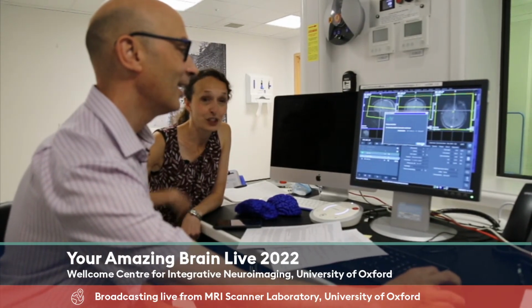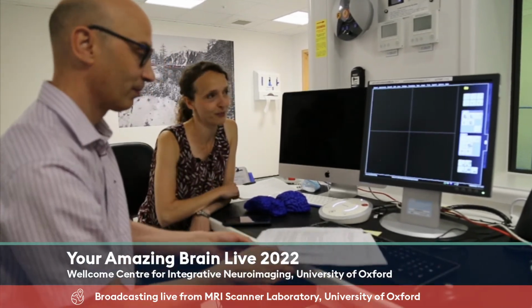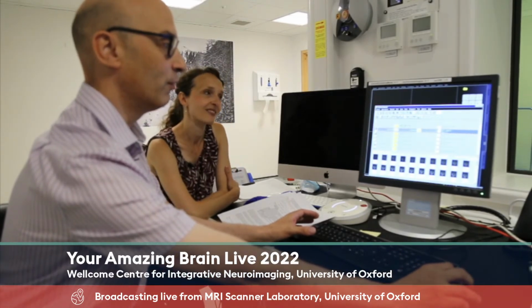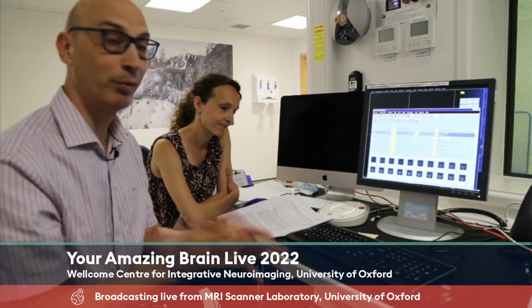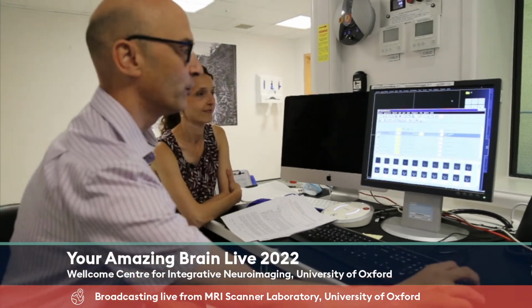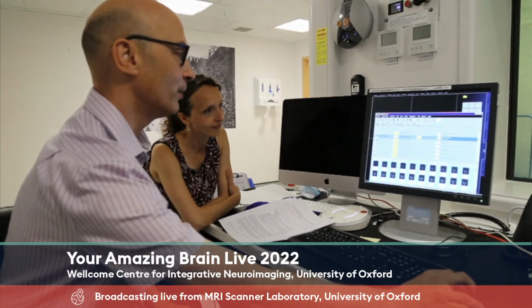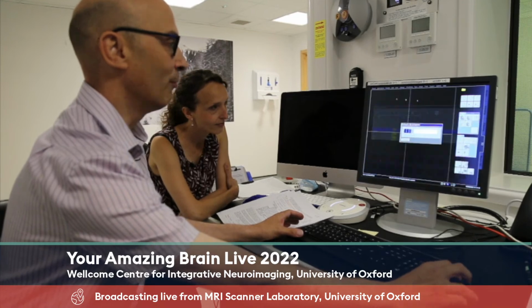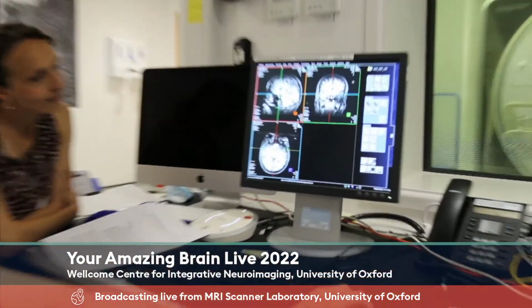Okay. So the measurements are coming in now as we speak, but it takes a little bit of time. So Stuart will talk us through what we're going to see. Right now we're taking a movie of what's going on inside Barbara's brain. But before we look at those movie pictures, we want to look at what her brain looks like. Just a bit earlier, before we came on the live experiment, we took a picture of Barbara's brain, and I'm just loading it up onto the screen now.